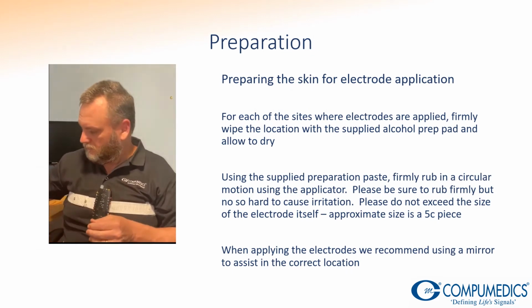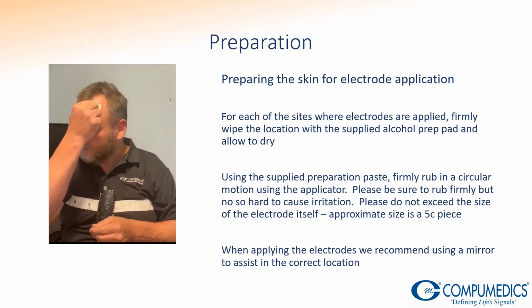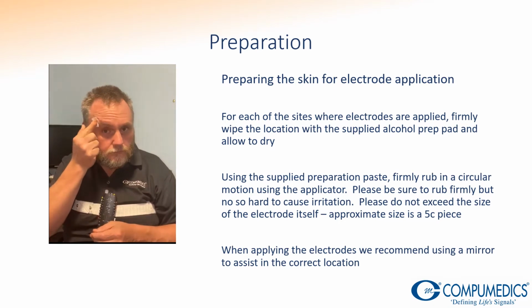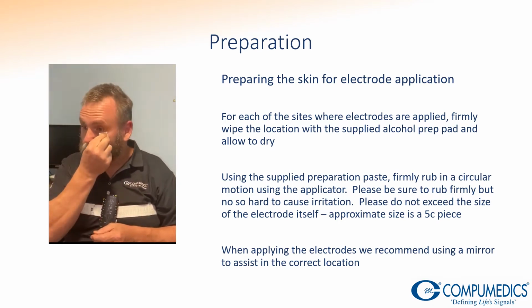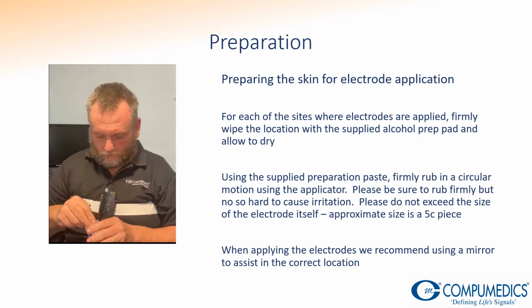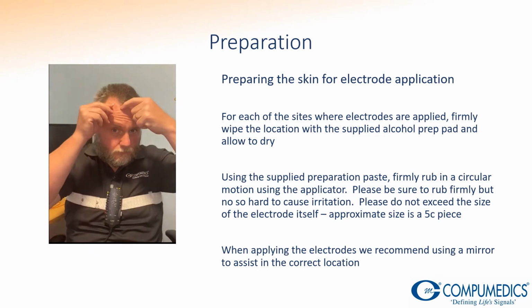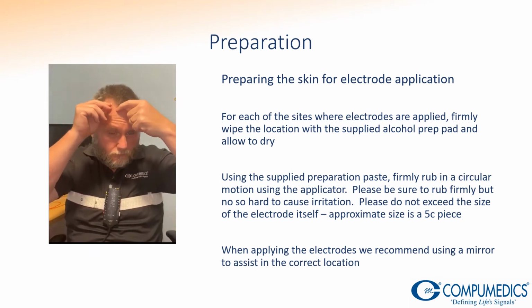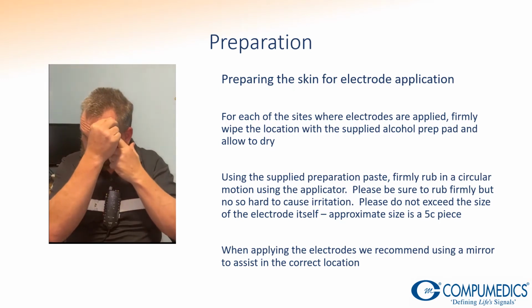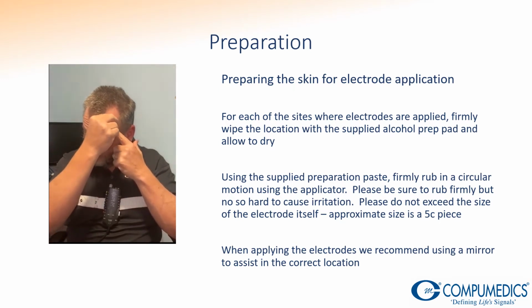Preparation of the skin for the electrode application involves wiping down with the alcohol wipe pads firmly and allowing it to dry. Use the supplied preparation paste. Firmly rub in a circular motion using the applicator. Please be sure to rub firmly but not so hard as to cause irritation. Please do not exceed the size of the electrode itself. When applying the electrodes, we recommend using a mirror to assist in the correct location.